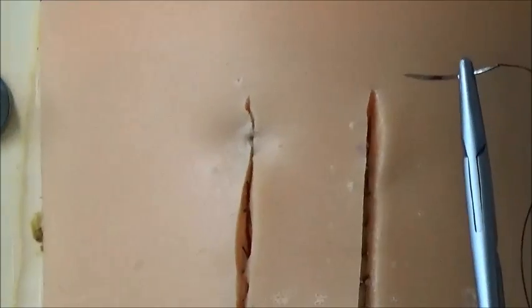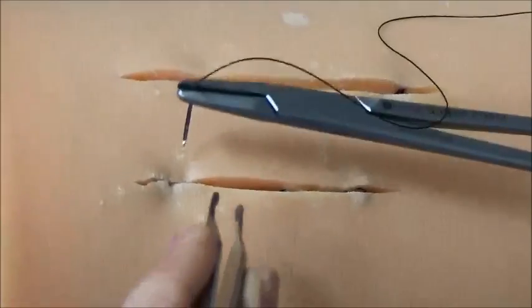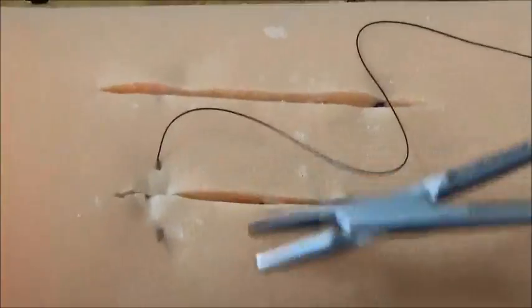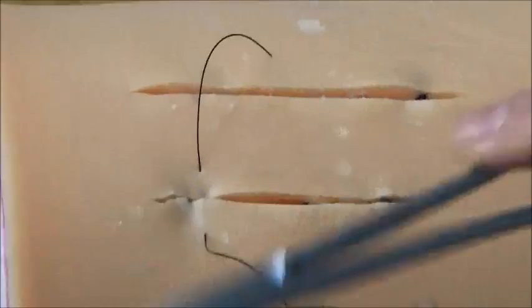If I'm suturing a vertical incision, as sometimes may happen in large animal, then I'm going to start and go from right to left for myself and from top to bottom. So in this case, the reason that I'm choosing to start there will become apparent in just a minute. So I draw this through, and like other continuous patterns, I go ahead and tie my first knot.